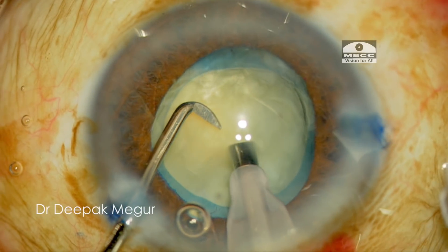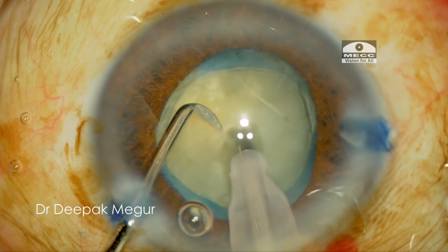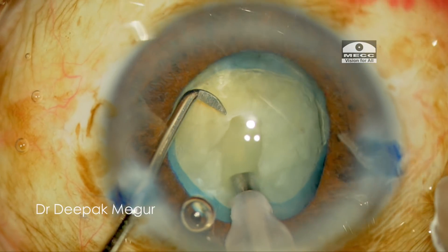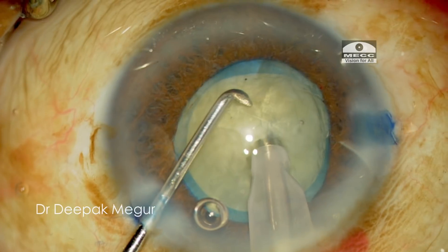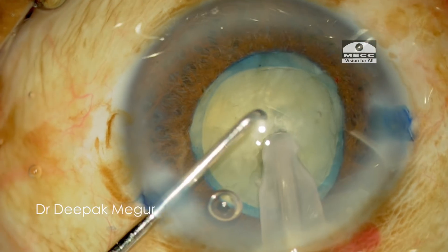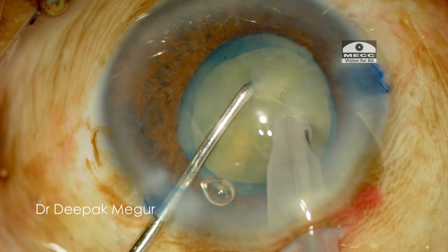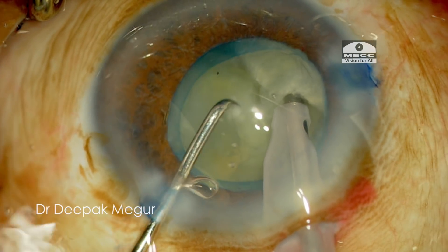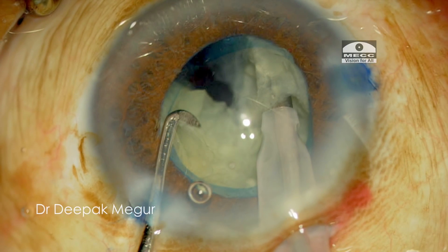Moving on to phacoemulsification of the nucleus, I'm using a direct chop technique. The phaco tip is buried into the substance of the nucleus in the central pupillary zone, and then using the sharp chopper, I place it in front of the phaco tip and score the nucleus vertically down, at the same time pulling my phaco tip with the nucleus slightly up. This ensures the first crack, and then I'm laterally separating the fragments.